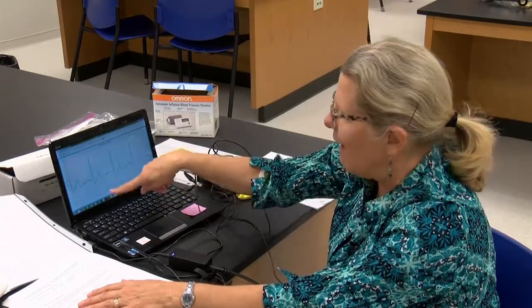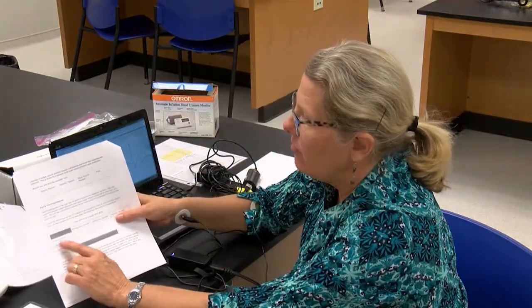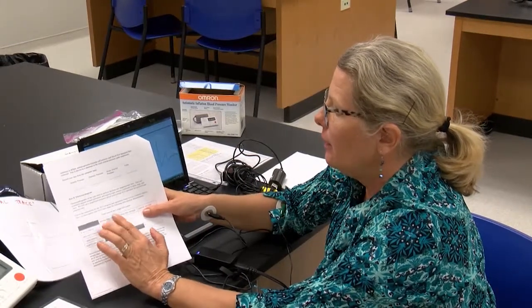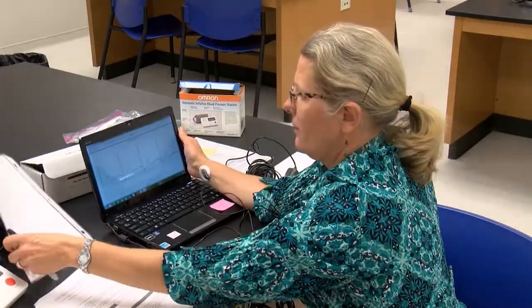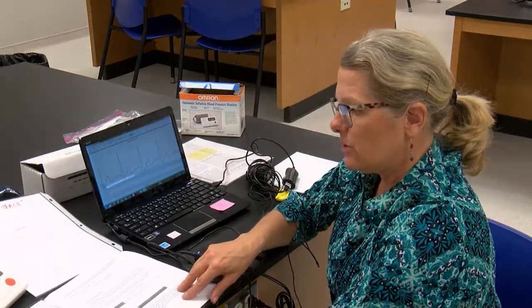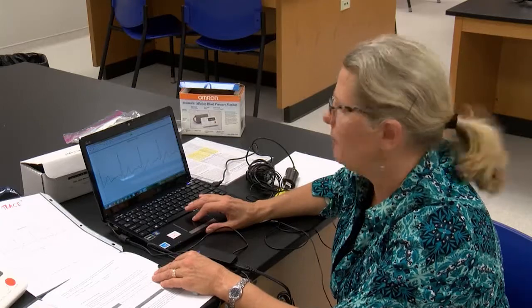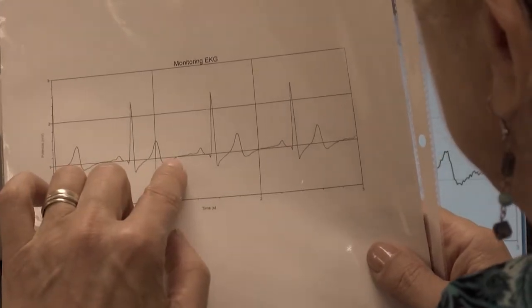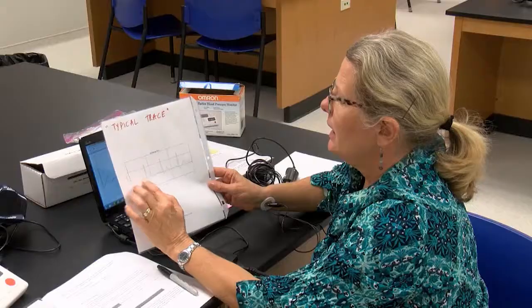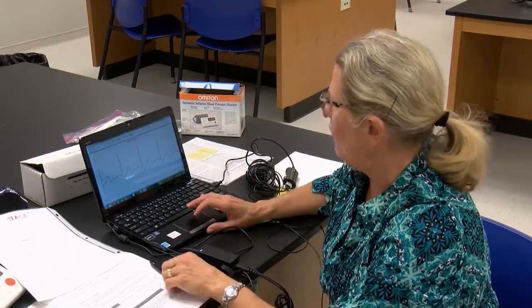Now, if I had hooked these up backwards or something, we might see the QRS wave going down. So what we're going to do is measure my P wave, my QRS, and my T. You're going to put data in these, and I will write down the data for you while we're doing it so that we don't get too confused. So we'll just have to use this trace. It must be from the caffeine from this morning, because a typical trace doesn't have all that noise. See how much smoother this is? It's much smoother. But caffeine does kind of get you a little bit jittery, or at least it gets me jittery. My husband, on the other hand, no, but it does get me jittery.